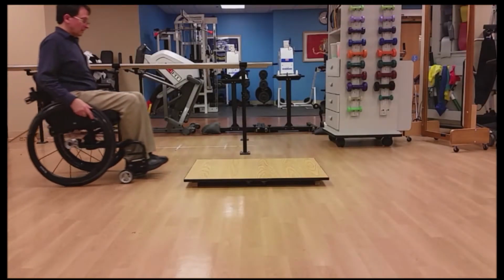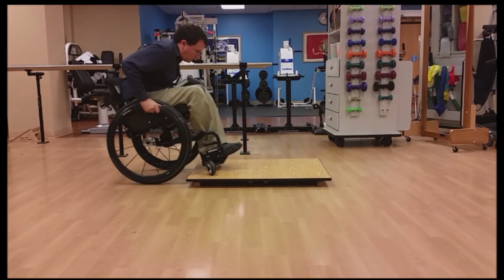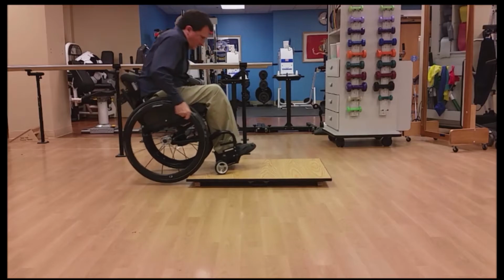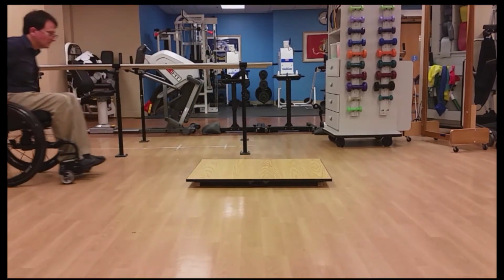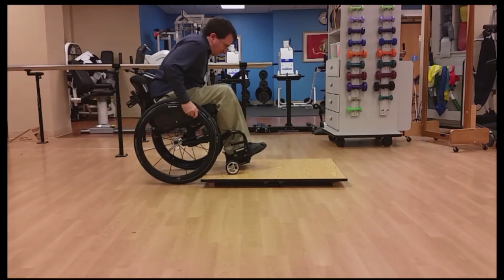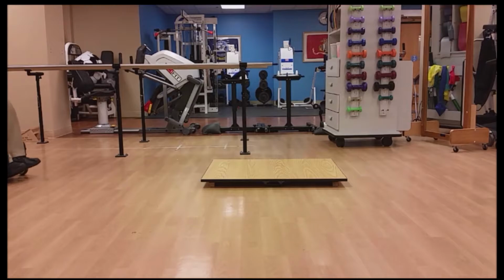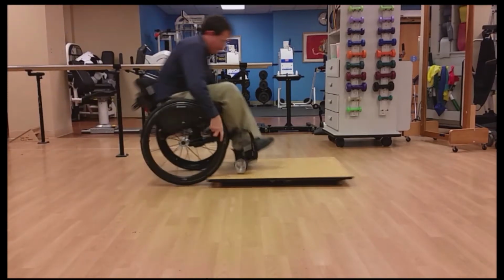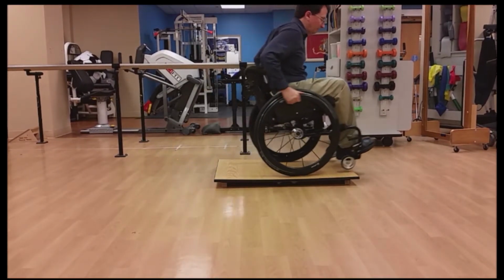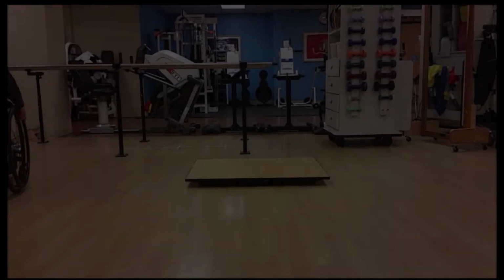You know, no chair does this on the market these days. So again, I'm trying to use my huge muscular arms there to get over. Not going to do it by not having momentum. If I timed it right, I probably could have got it there. So I could do it.